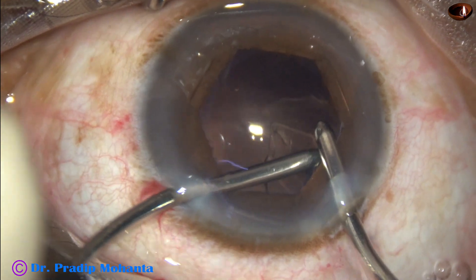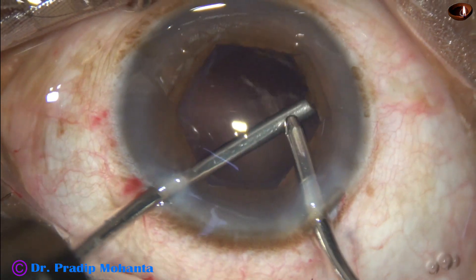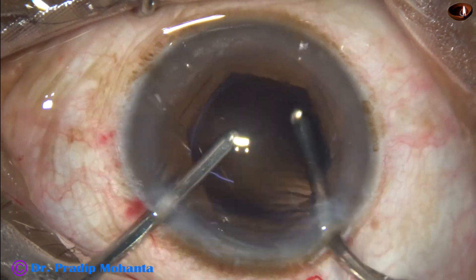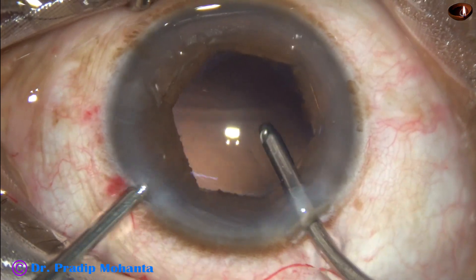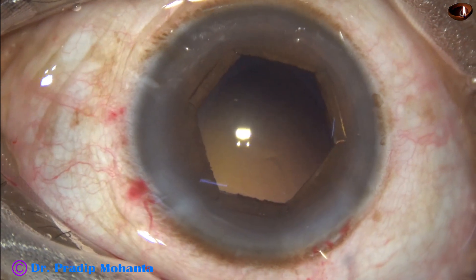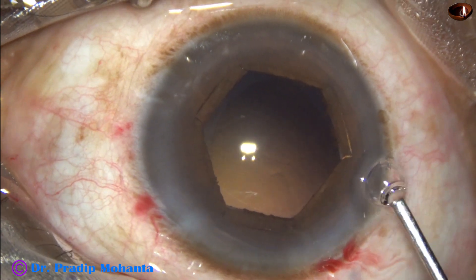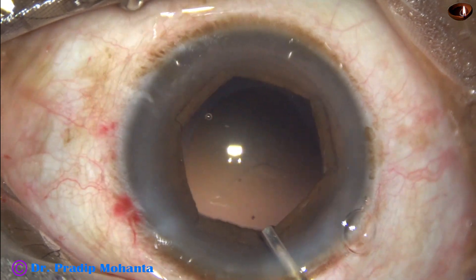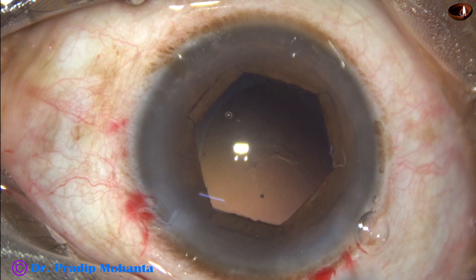I am using bimanual irrigation and aspiration for removal of the cortex. The anterior wall of the main wound is lifted up and the anterior chamber is well maintained. Now the capsular bag as well as the anterior chamber is filled up with 2% hydroxypropyl methylcellulose.